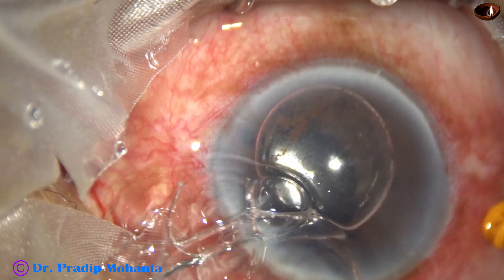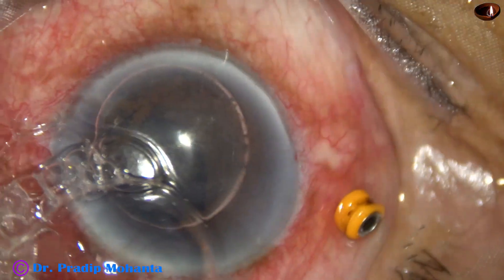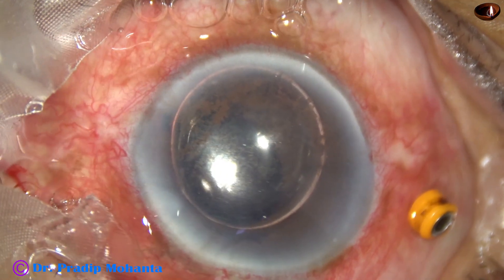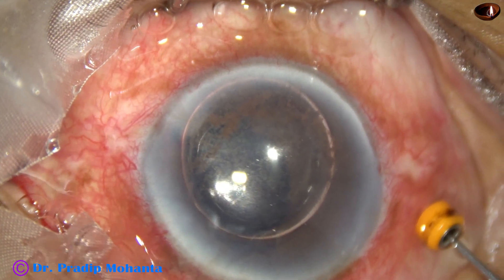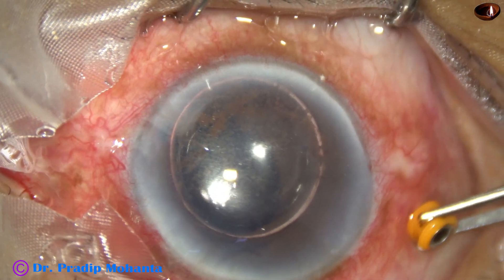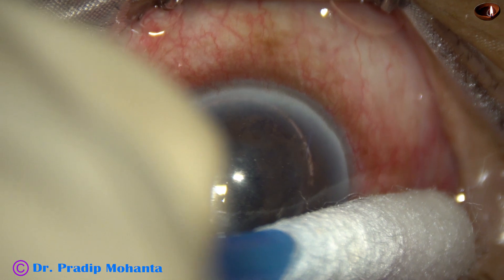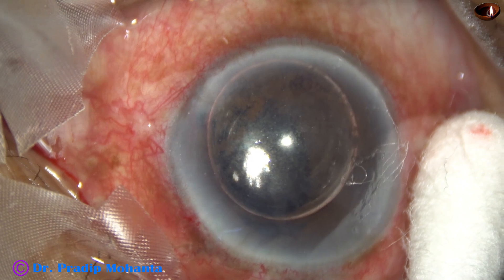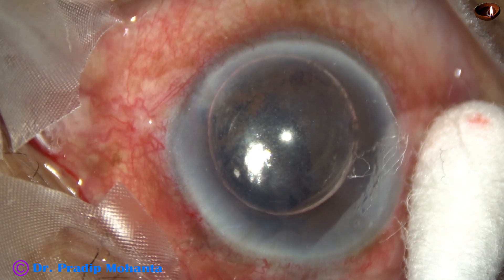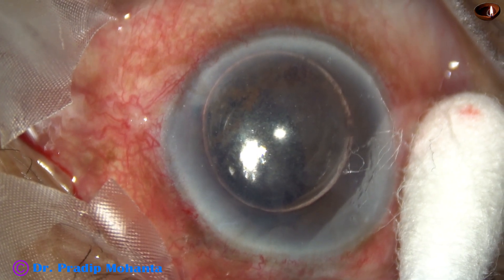Now I inject air. This is closure of the sideport. Now I remove the trocar and do some sutures over the sclerotomy area. Keep it pressed for some time, and the case is concluded.